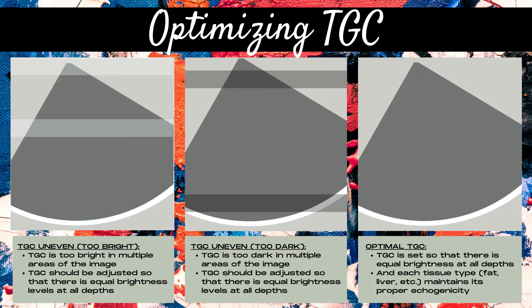You don't want to adjust the aorta, which is anechoic, to be the same brightness level as the liver, which should be a medium gray shade. In the middle image, the TGC is uneven because several sections are too dark. For an optimal TGC, shown in the far right image, the TGC is set so that there's equal brightness at all depths.